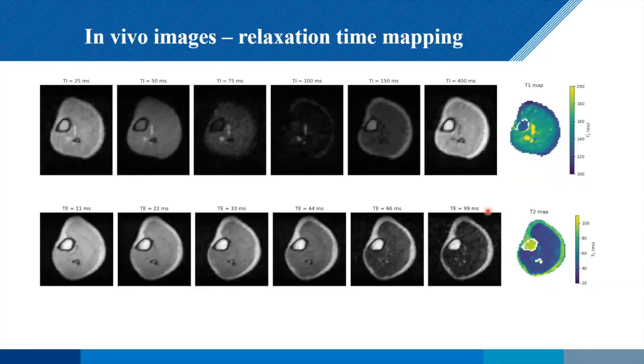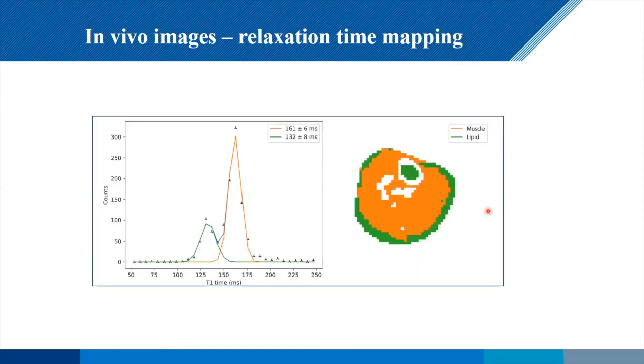We're also very interested in muscle, not just brain. The idea of being able to really do exercise inside a magnet is one of the great things, from a research point of view, of low field. Heming Khan in our group is very interested in that. So again, here's T1, T2 maps in terms of the muscle. As one would expect, the segmentation here is simple lipid and muscle, but again, showing very clear definition there. And so what we can do in terms of exercise is start to look at changes in the T2, which come from muscles producing edema, in a much, much easier way than having to build an MR compatible bicycle and stick it inside the magnet.